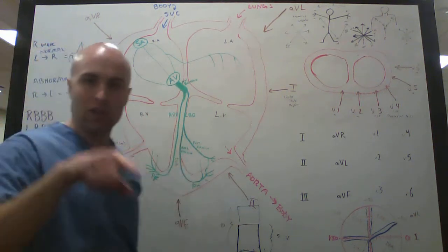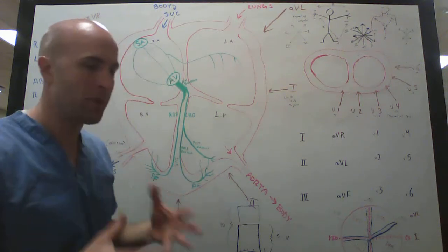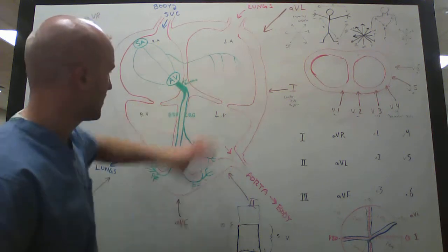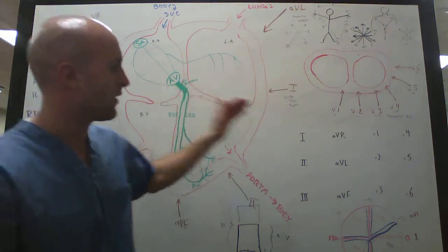Anyways, when we're looking at these readouts that we're going to have on the EKG, you've seen a little line that goes up and down. That's going to be kind of a representation of what it's doing in relation to the vectors of force, or vectors of electrical force in the heart. And it's going to show up on these different readouts.